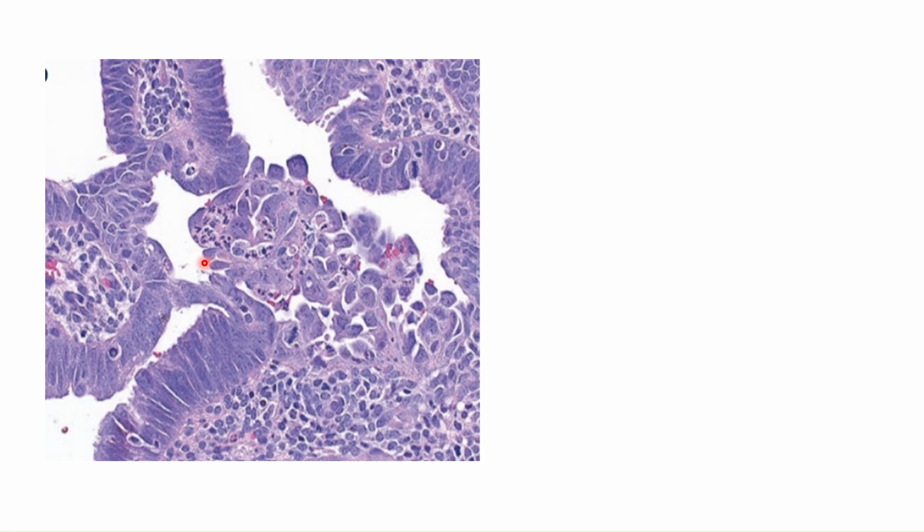Here also in this section we can see glands showing highly atypical nuclei, showing hyperchromasia, pleomorphism, columnar appearance, very low cytoplasm showing high NC ratio, but we can see here abnormal mitotic figures, and this area shows discohesiveness.